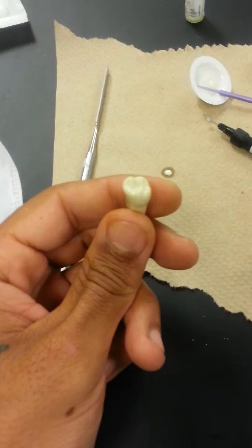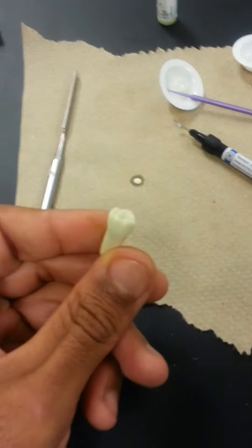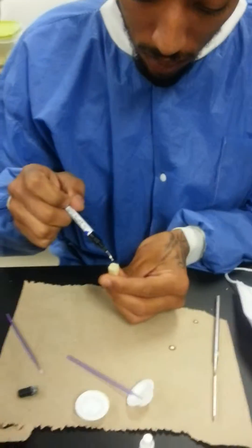Alright, once I've used air and water for 20 seconds and made sure the tooth is dry, I'm now ready for my sealing. So now I use one drop of sealing.